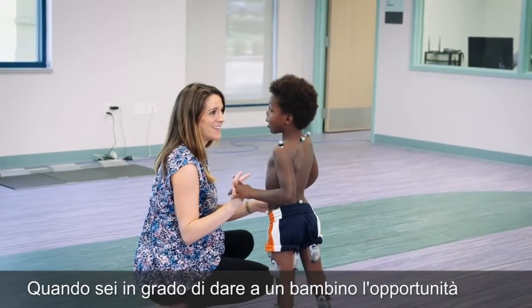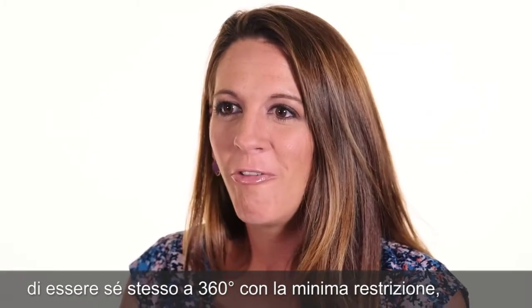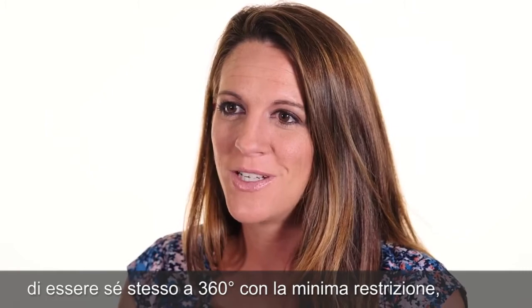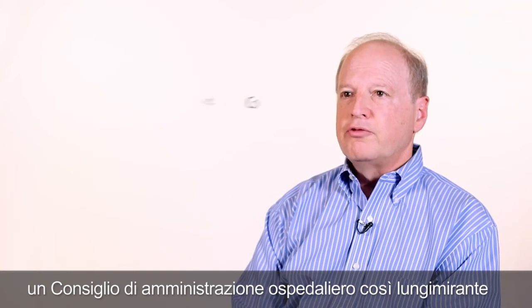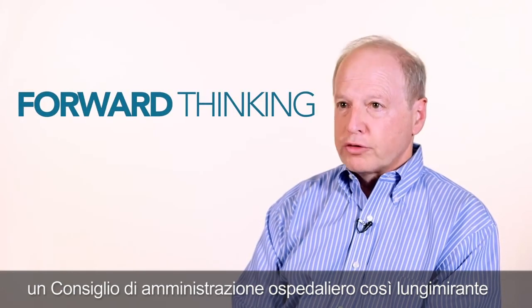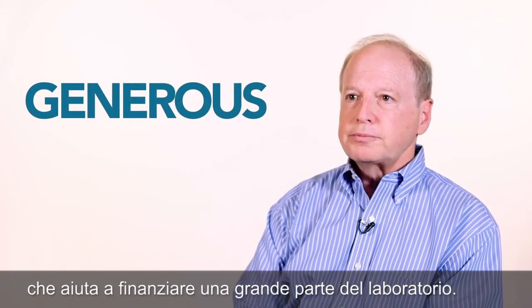When you are able to give a child the opportunity to be their greatest self with the least restrictions, that's what it's all about. And we are thankful to have the support of a very forward-thinking hospital board of directors, system board, and a very generous community that helped fund a large portion of the lab. On behalf of the team, I just can't thank them enough for that.